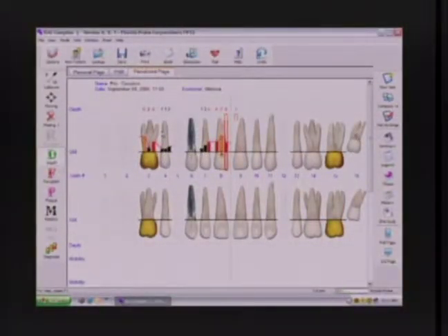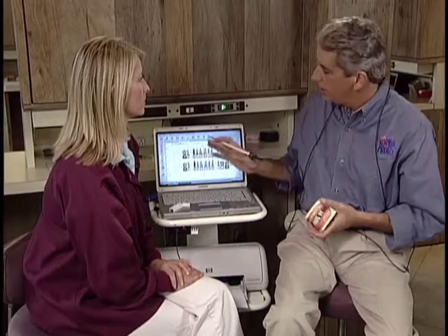Warning. 4. 2. Midline. And also notice that it enunciated crossing the midline. That's going to help you keep on track throughout the exam so that you're not going to be off any more than a quadrant at most.